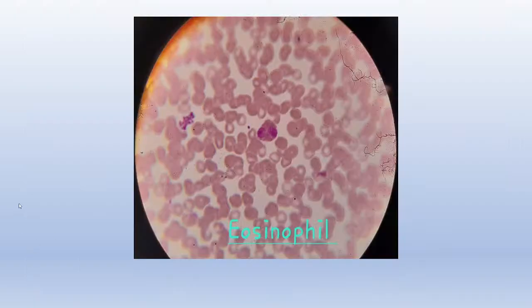So over here I have an eosinophil, right? In eosinophil, the main characteristic is the headphone-like nucleus to identify it, but that is not a sure thing. The main thing is the name: think eosin. It stands for the pink color stain we use, hematoxylin and eosin. You have two stains, right? H and E. Eosin is the pink color stain. In eosinophil, we have pink granules. You can appreciate the pink granules over here. That is the eosinophilic stain.